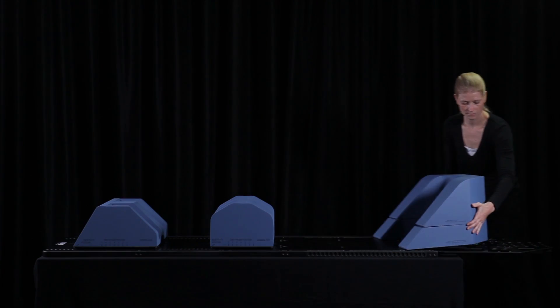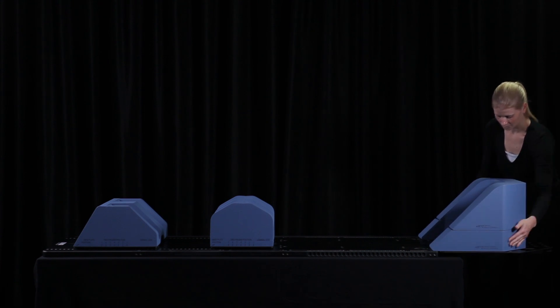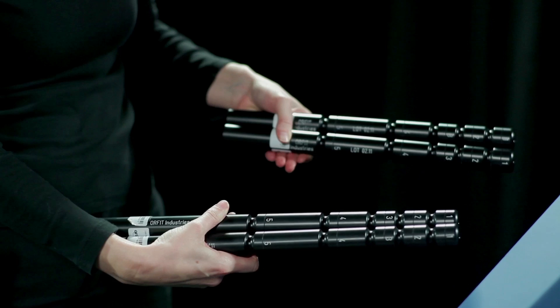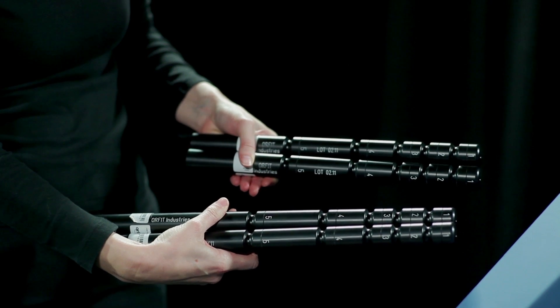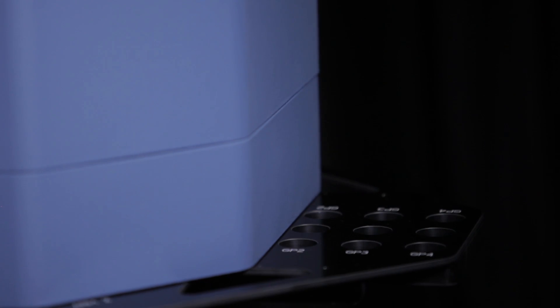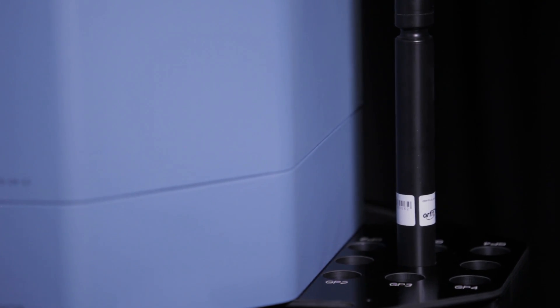There are two positions for the armrest cushion: one in the cranial direction and one in the caudal direction. A set of short and a set of long grip poles can be used on the armrest support plate in the position most suitable for the patient. You can choose to use two grip poles at the same time, so one for each hand, or you can use one grip pole in the middle for both hands.